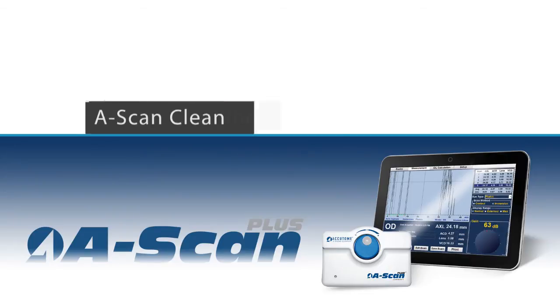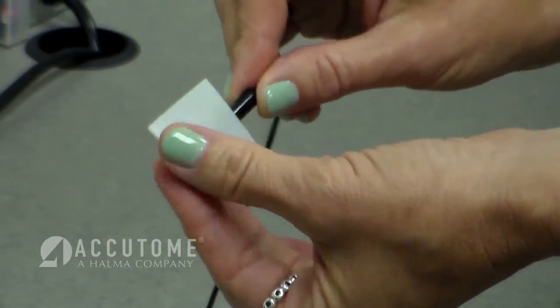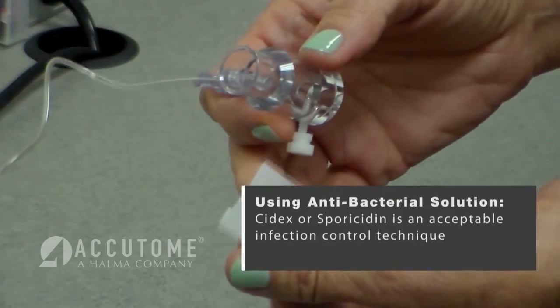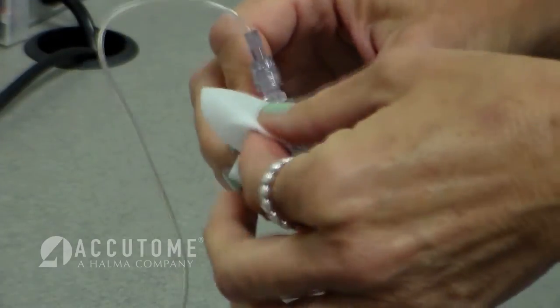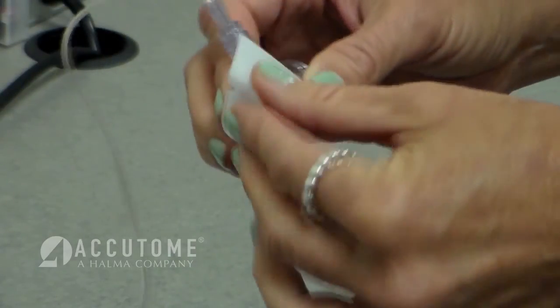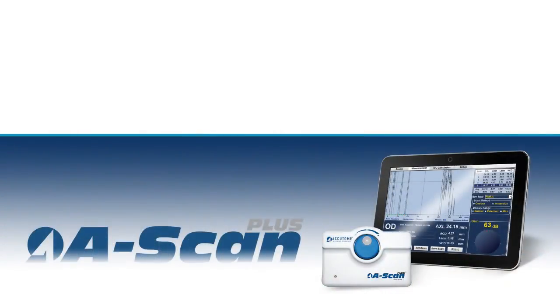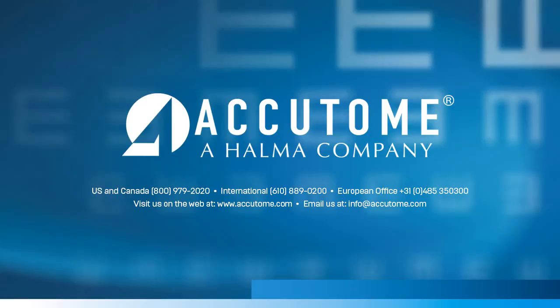Cleaning. Clean the A-scan probe by wiping or soaking only the tip with alcohol. If a higher level of disinfection is required, an antibacterial solution such as Cidex or sporocetin is an acceptable infection control technique. The immersion shell can be fully submerged in alcohol, Cidex, or sporocetin. Do not autoclave either the probe or immersion shell. Please feel free to contact your Accutome representative regarding any questions or to purchase any of the necessary supplies to complete the A-scan examination.